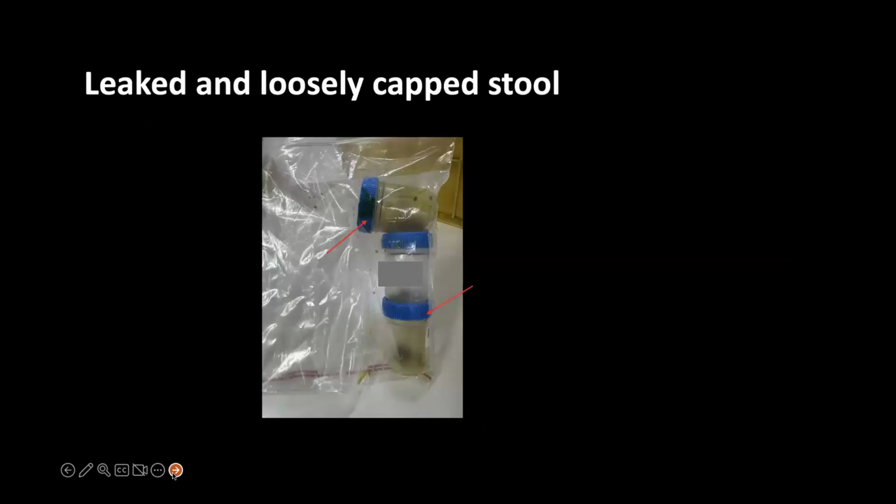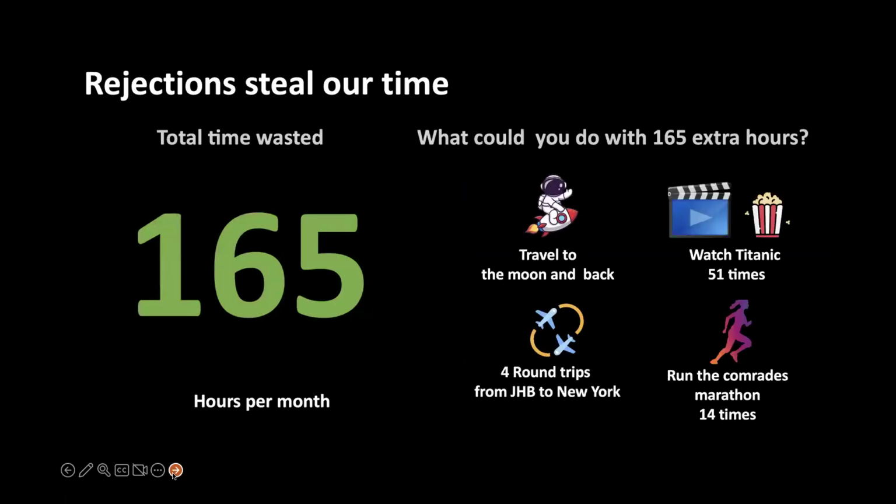When capping containers, a small step like ensuring that the universal container is capped could prevent over 10% of rejections. Next slide.